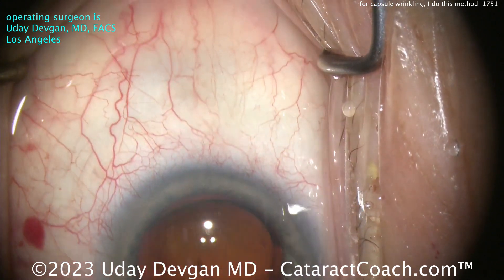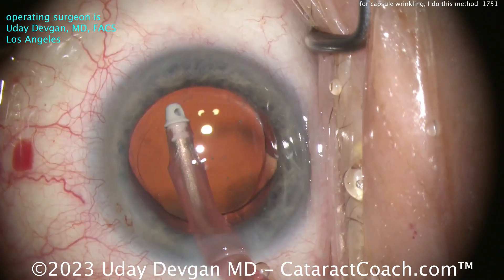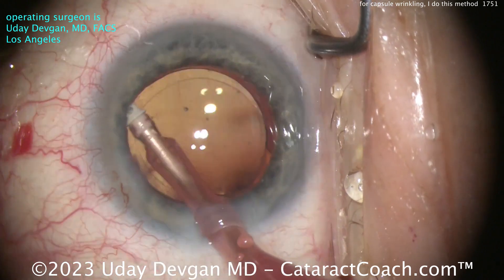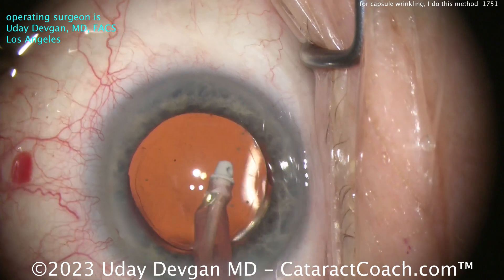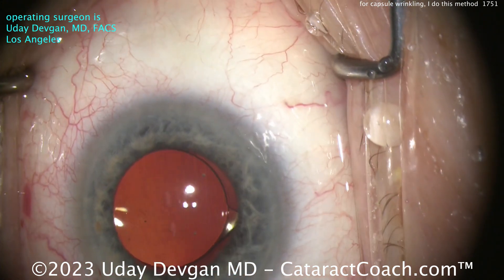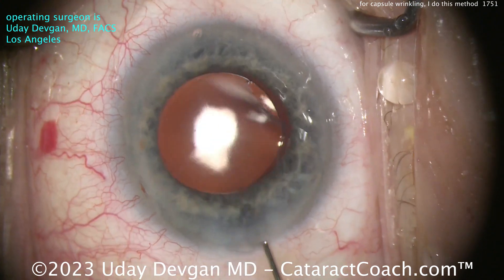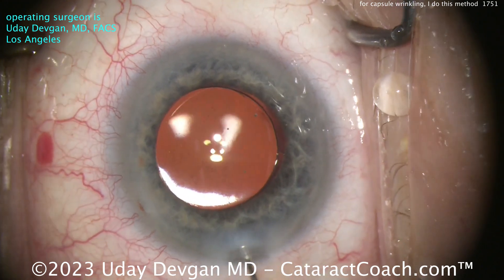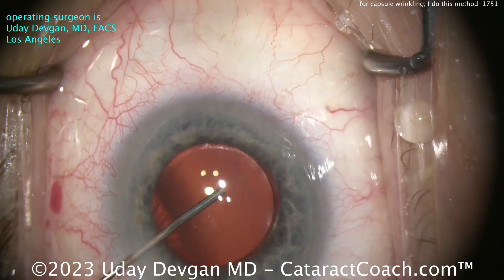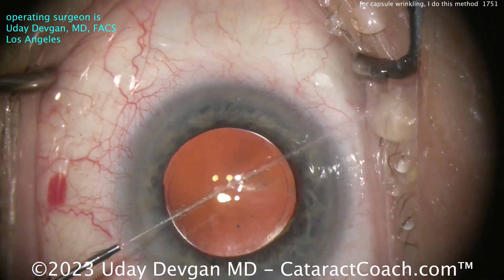Going behind to remove the viscoelastic — a little bit slower on this, slow down the flow rate, slow down the vacuum. Cleaning up, a little more polishing of the underside of the lens capsule, taking out all the viscoelastic from the anterior segment. That's a nice-looking rhexis — beautiful overlap, this looks fantastic. This patient had a fantastic result. When you see that wrinkling of the capsule starting the rhexis, that means zonular laxity — in this case just global laxity from old age, not pseudoexfoliation or trauma. Keep these important pearls in mind.